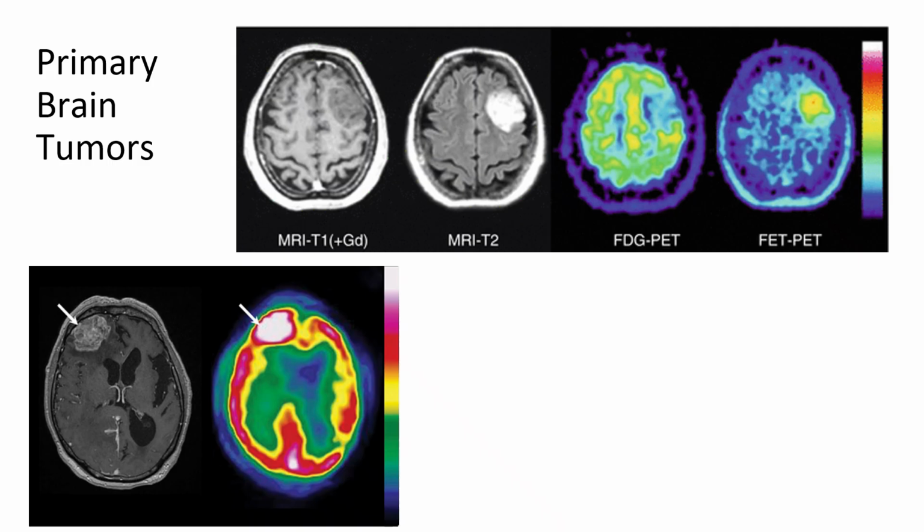And that's done because it can tell if the tissue's dead or if it's inflamed, because if it's dead, it's not going to take up FDG at all. And if it's inflamed, it will. On MRI and CT, it's really hard to tell if something has necrosis or it has inflammation, but FDG is able to show it very clearly. And like I said, we'll discuss that later.